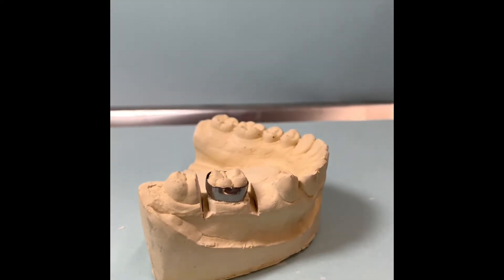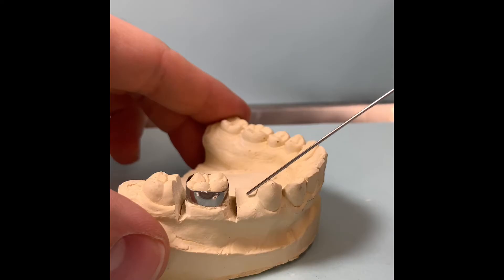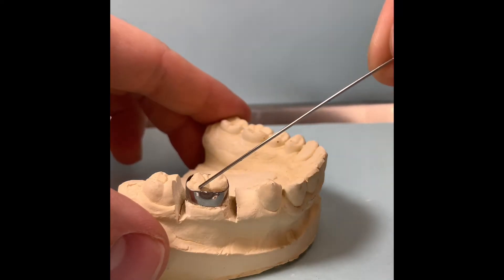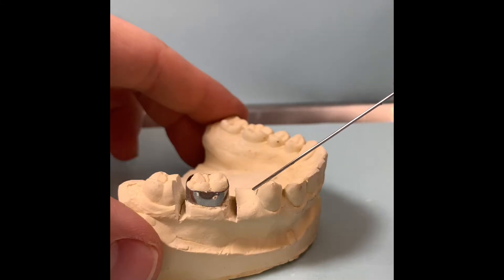This tutorial is on how to bend a band-in-loop space maintainer. This patient has an edentulous area where their second premolar will go, so we want to create a space maintainer that's going to hold this space and make sure no shifting occurs.